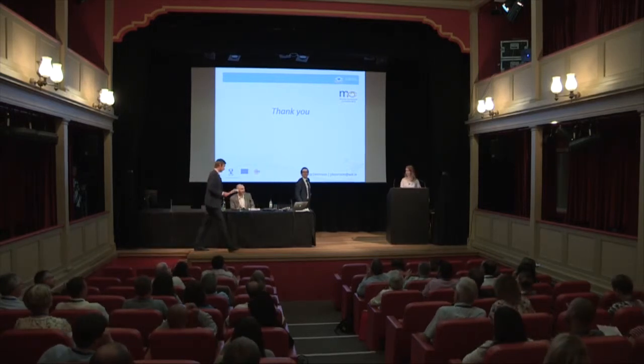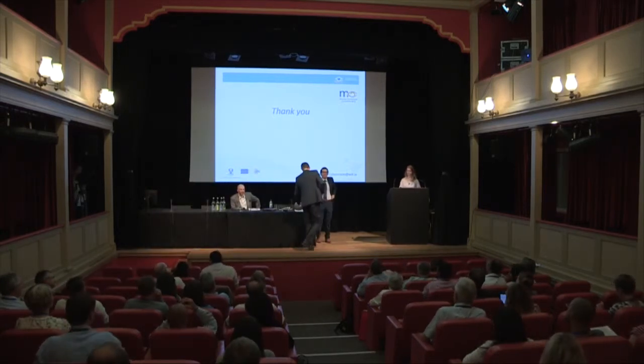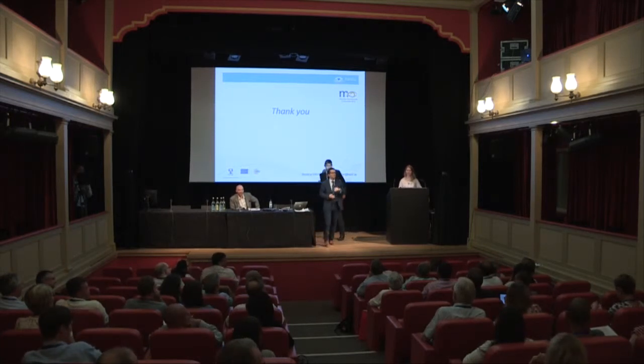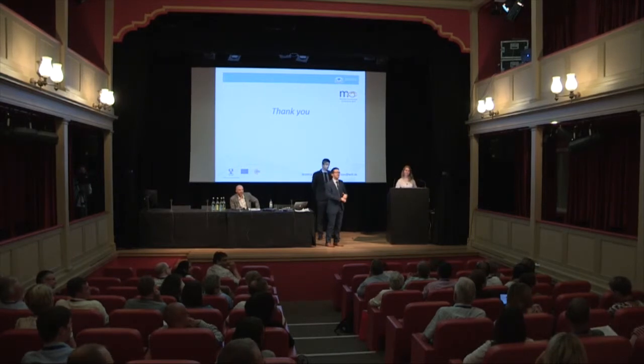Do we have any questions or comments for the measurement of macular pigment, or for Jessica? Yeah, Bill? In our humble clinic, we found that autofluorescence is probably, from a clinician's point of view, the most repeatable, as opposed to, say, other commercial macular pigment screening devices. What are your comments there? Would you agree? I mean, we tested the repeatability of all of our devices, and they were all equally repeatable.